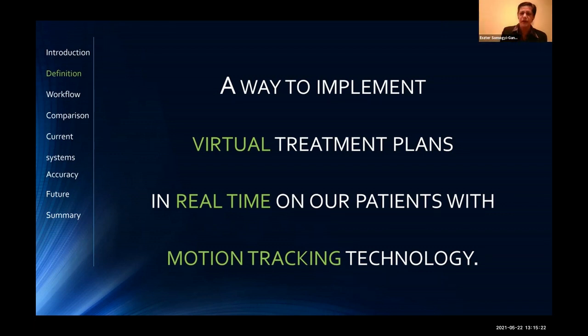Now, when I say motion tracking, what I mean is what you might be all familiar with. You can take whatever big cinema movie today, where we see blue people or monkeys or monsters. Very often these characters are based on actors, and there's usually a camera that is going to capture how the actor moves, and then a computer is going to change these facial movements and implement it on an imaginary character. Now, the camera is not enough. In our case, here you see that there's only one camera in front of this character.